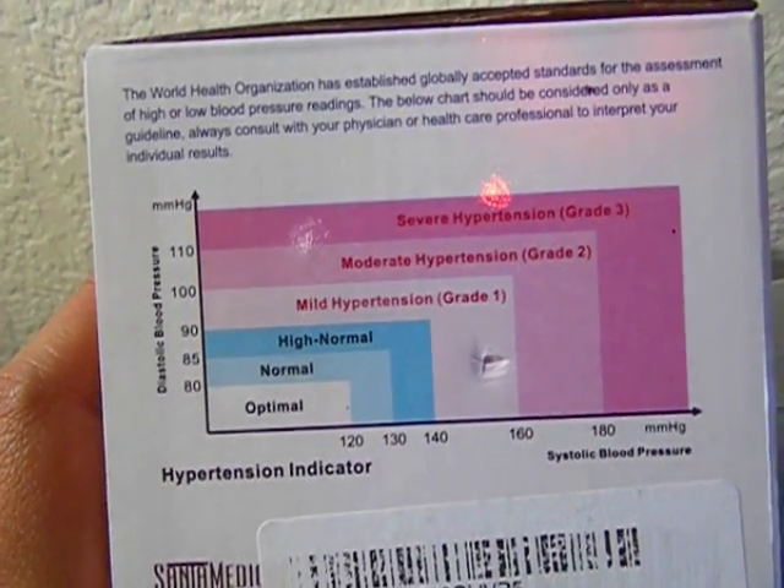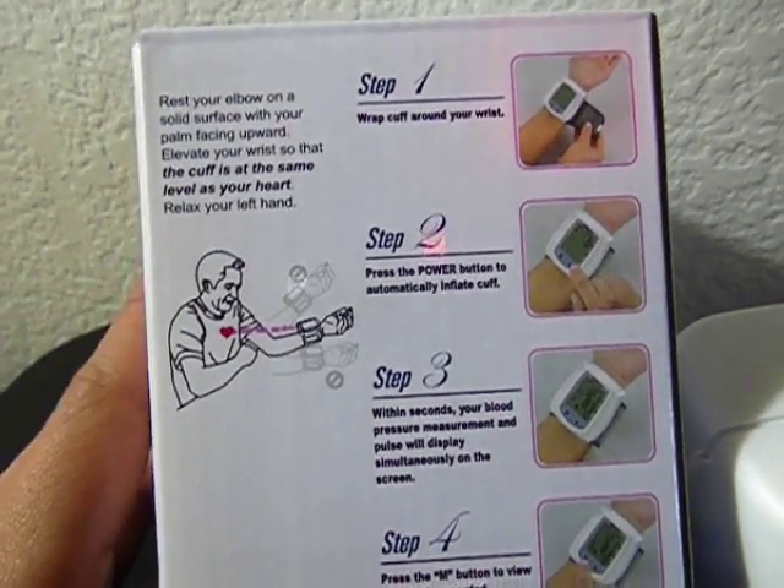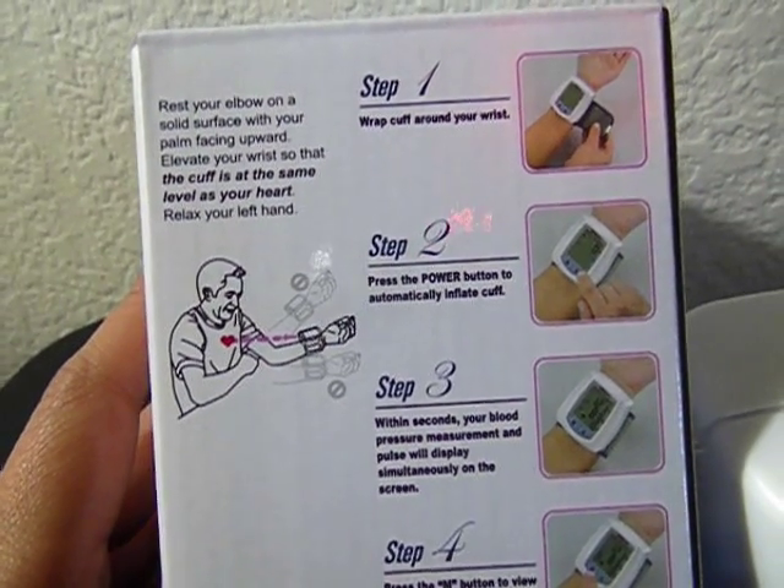Here is a chart of what's normal and abnormal for blood pressure. And here are the steps on how to use the blood pressure monitor.